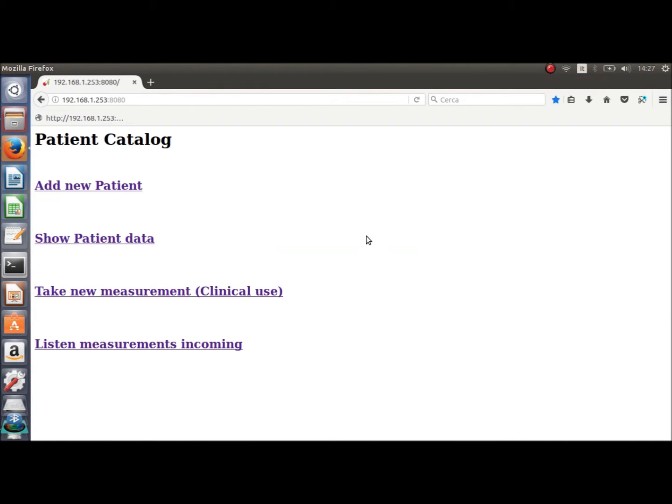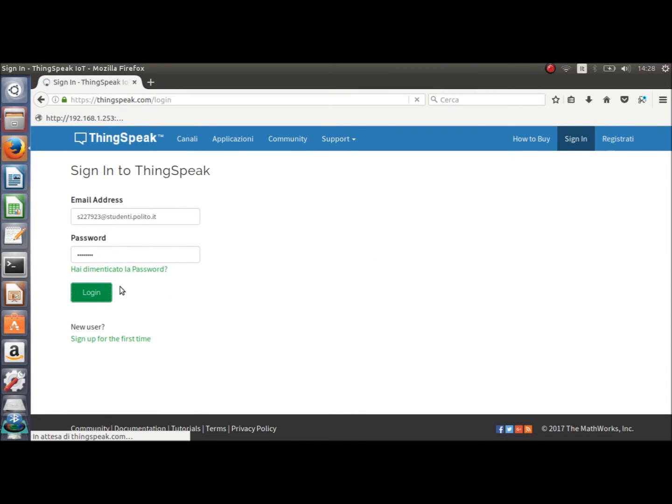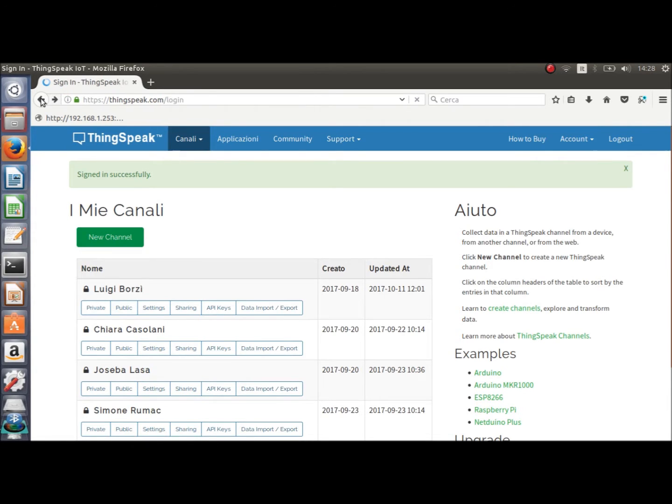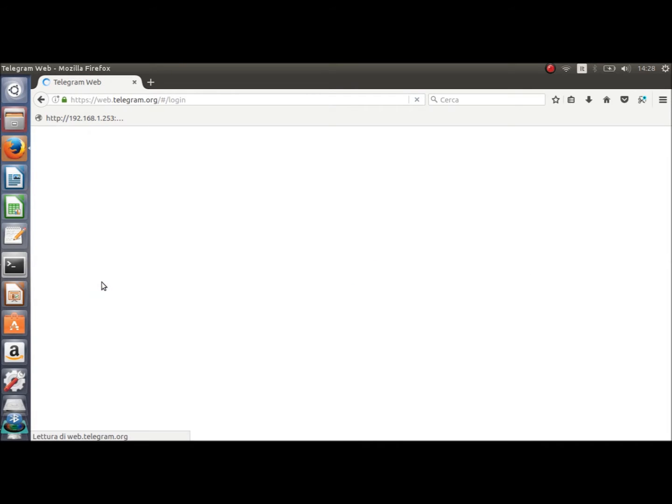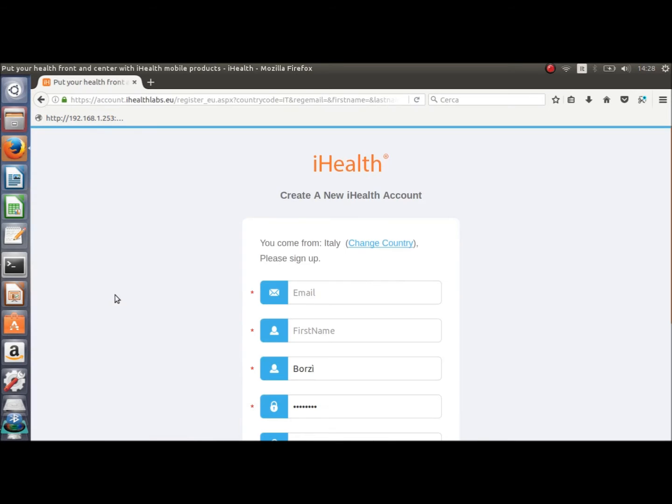So we reach our web service, and the first step is to add a new patient to the database. We fill out this form, writing basic patient info like name and age, physiological information like parameters, range, and additional info. We also need to write down communication info to let the program automatically communicate with Telegram bots, ThingSpeak channels, and iHealth. Links for getting such data are provided. ThingSpeak data is obtained when a new channel is created, Telegram data when a new bot is created, and iHealth data when a new user registers to the iHealth app.